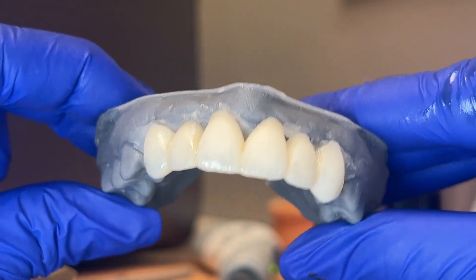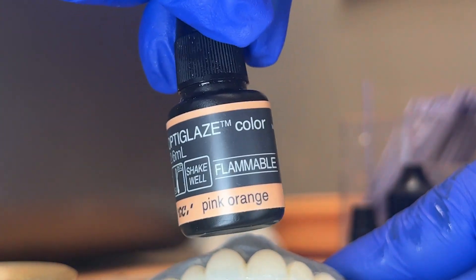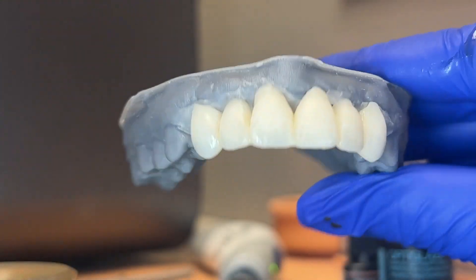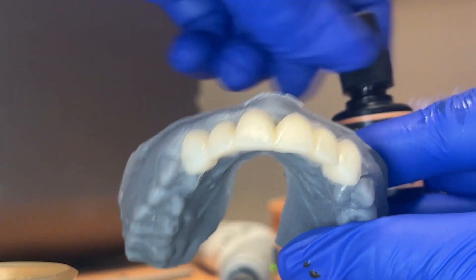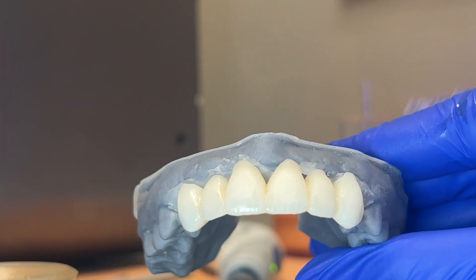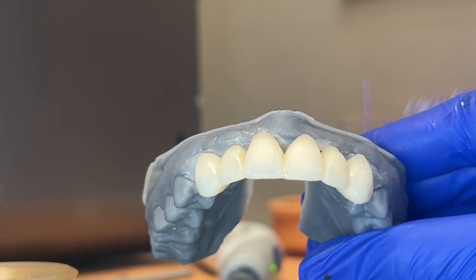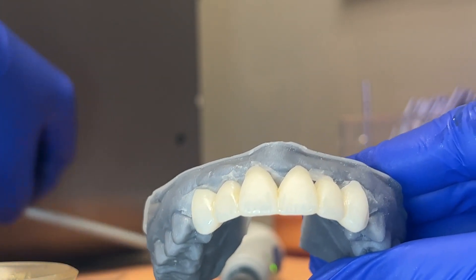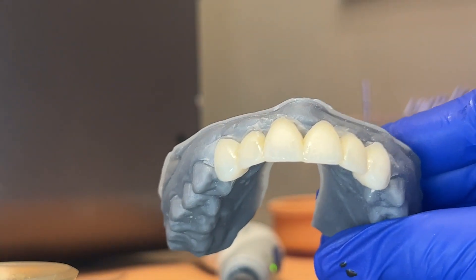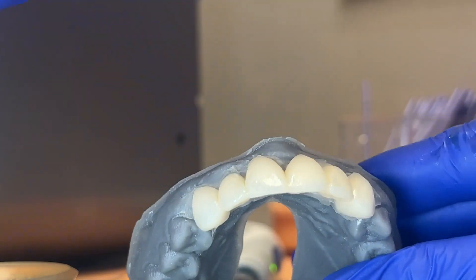So just some olive in the embrasures, blue on the incisal edges, and then we're going to do pink-orange for the body — two-thirds of the tooth — and we're going to stay away from the incisal third. You wouldn't think pink-orange would make that big of a difference, but I saw it, tried it, and it works really well.